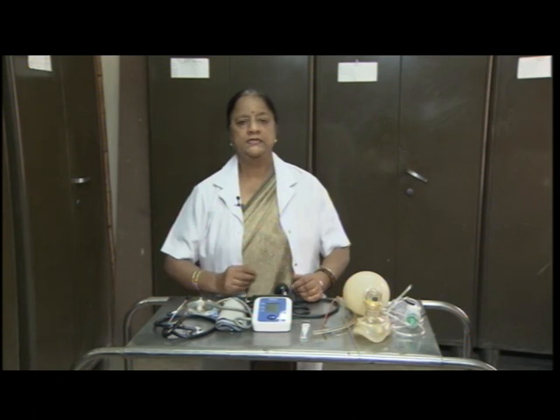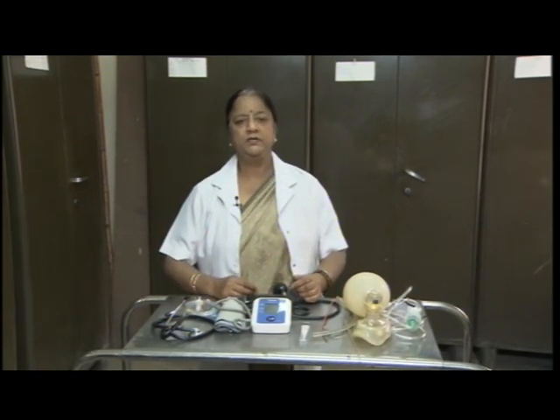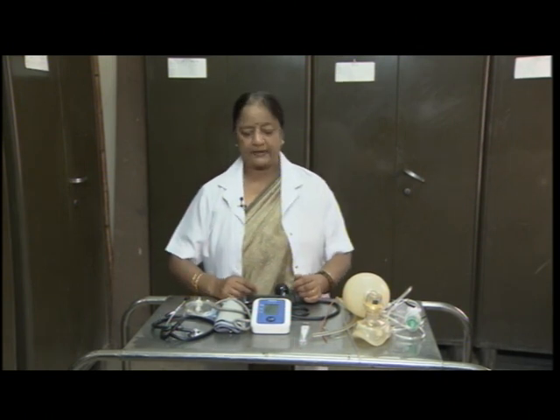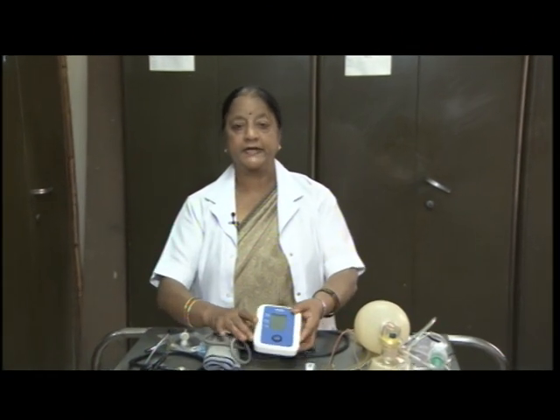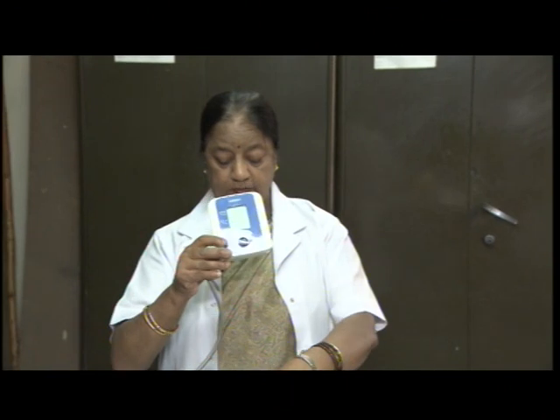I will show you some of the common equipment used for patient care which you will be using in your day-to-day activities, in your routine work. So, first I will show you taking of vital signs of the patient, that is, you need to take blood pressure of the patient by using this device.